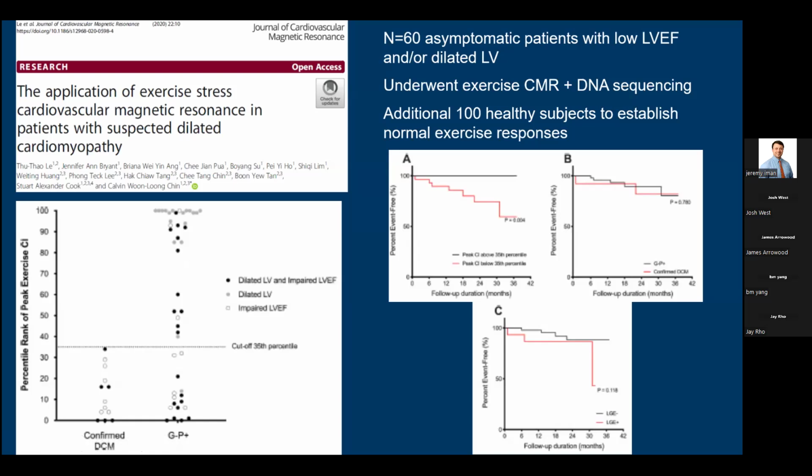And we see these patients sometimes, and we wonder to ourselves, is this low EF, or is it a little bit dilated? Is this okay for this individual patient? It's just a little bit down. They tend to exercise a lot. Maybe they've just got an athlete's heart.